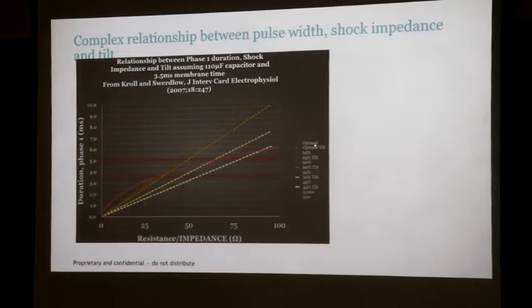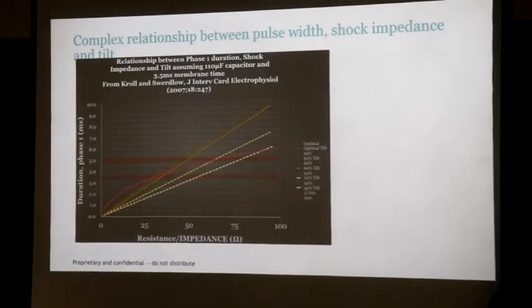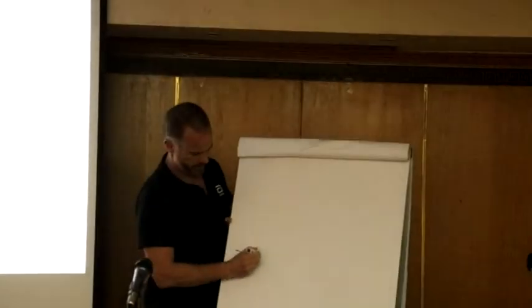So these numbers here, we saw the optimal tilt, right? The tilt of a waveform is, well, they often ask about it on an IBHRE exam, right? The tilt is this.